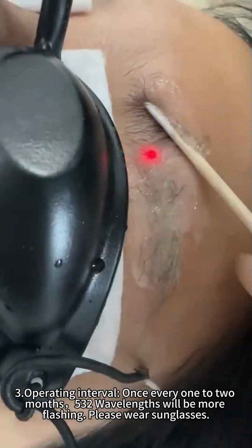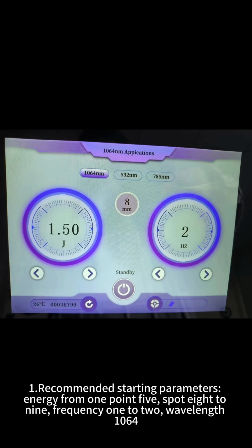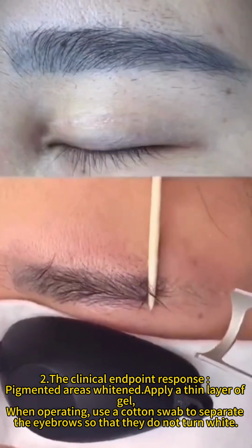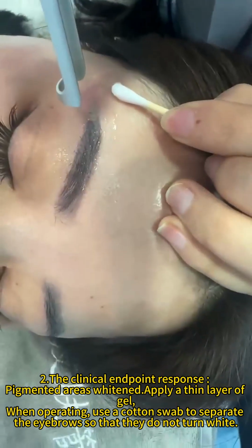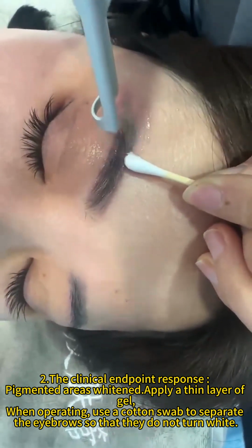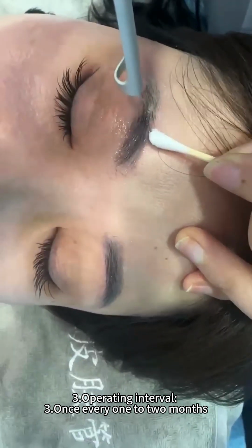The 532 wavelength will be more flashing, so please wear sunglasses. Non-invasive eyebrow shampooing, black. Recommended starting parameters: energy from 1.5, spot 8 to 9, frequency 1 to 2, wavelength 1064. Clinical endpoint response: pigmented areas whitened. Apply a thin layer of gel. When operating, use a cotton swab to separate the eyebrows so that they do not turn white. Operating interval, once every 1 to 2 months.